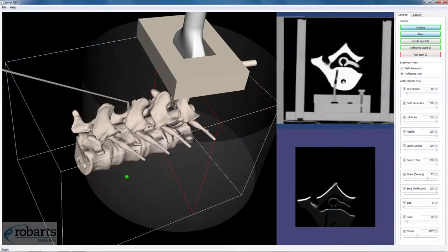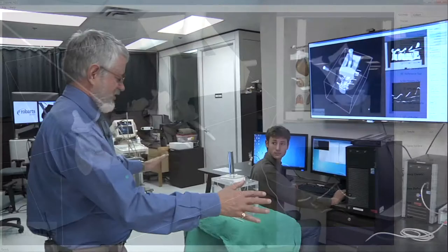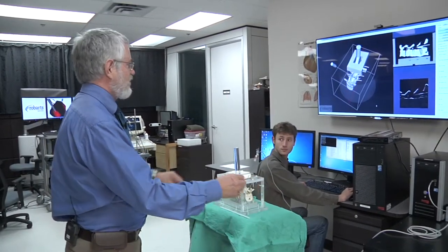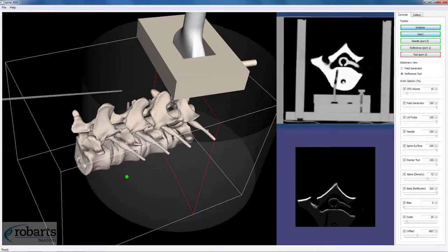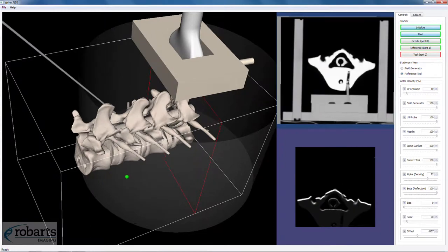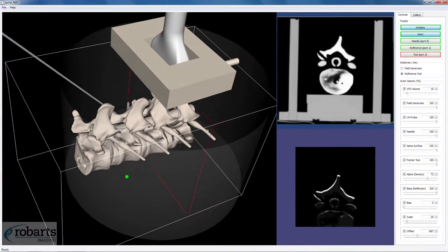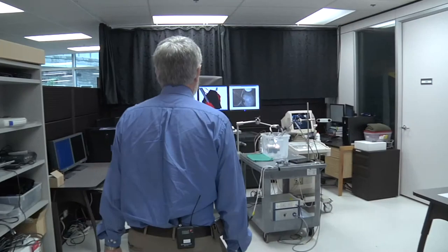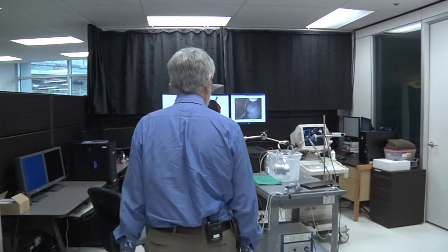All the surgeon sees is just the drape across the back of the patient, and so this display gives us the virtual look inside the patient while he's performing the procedure.